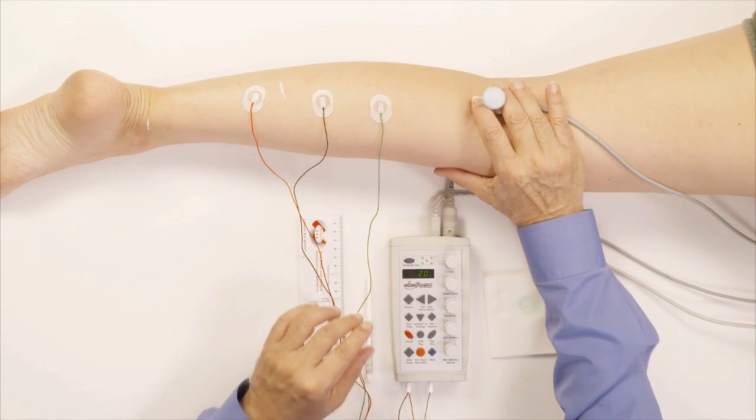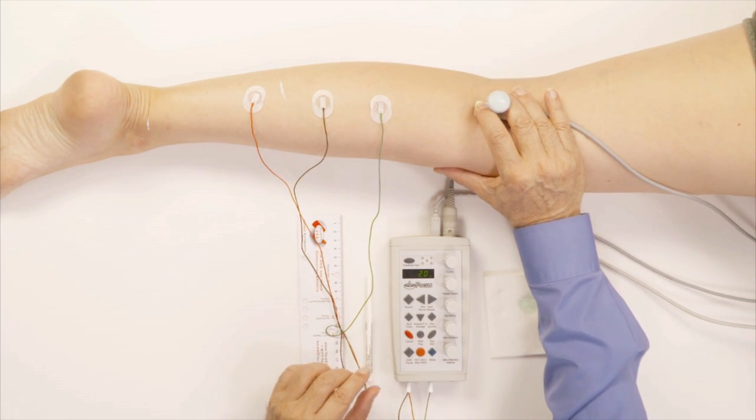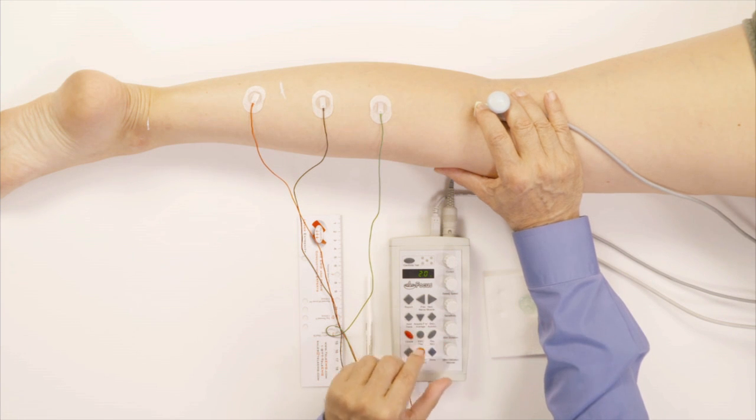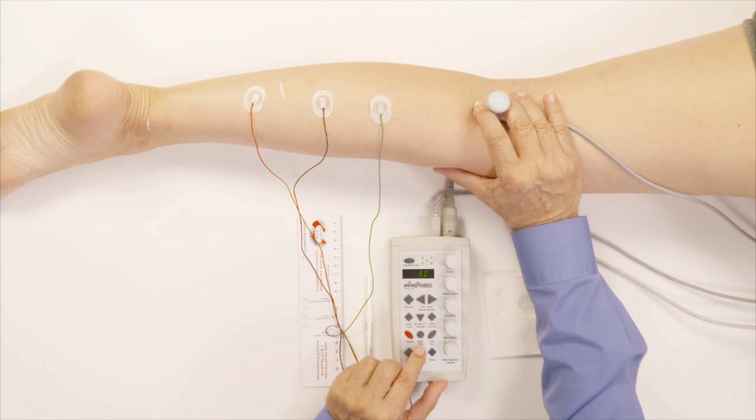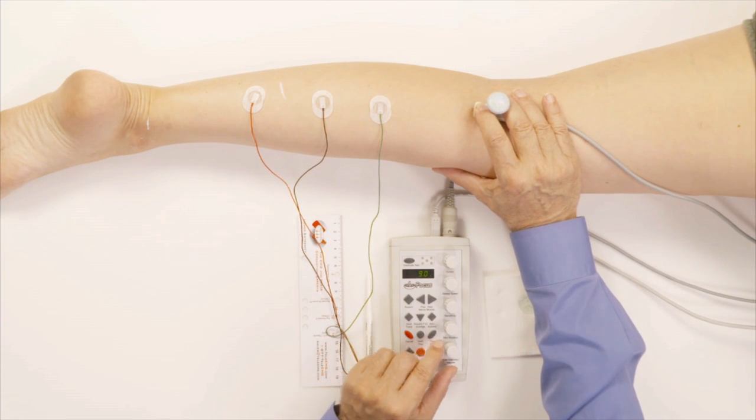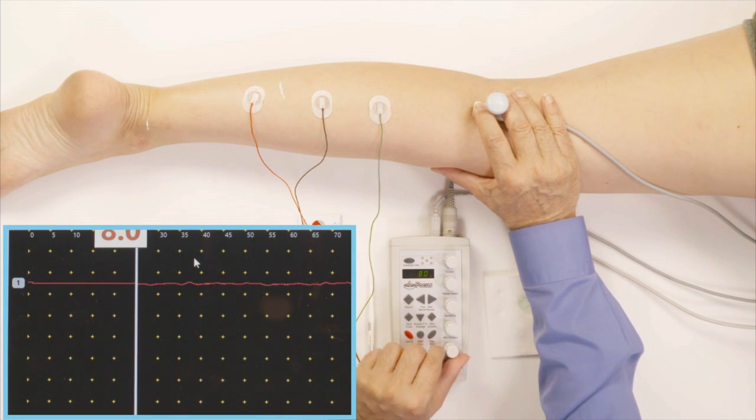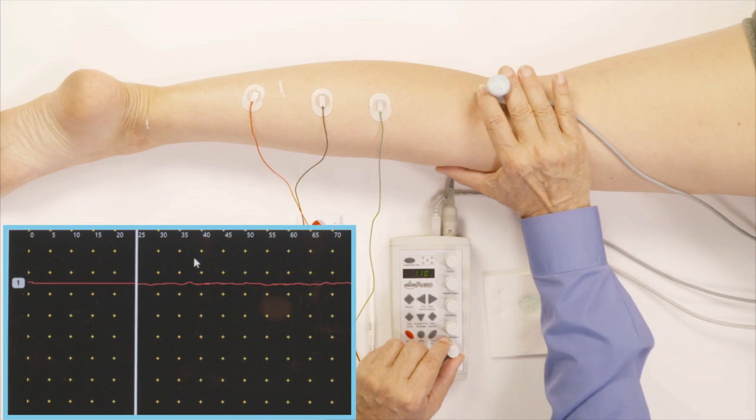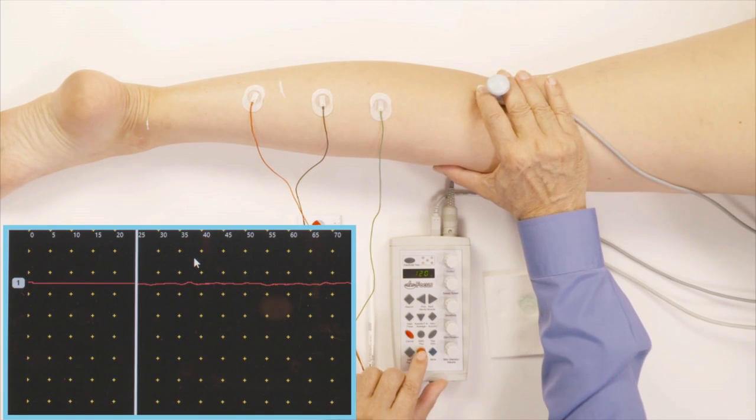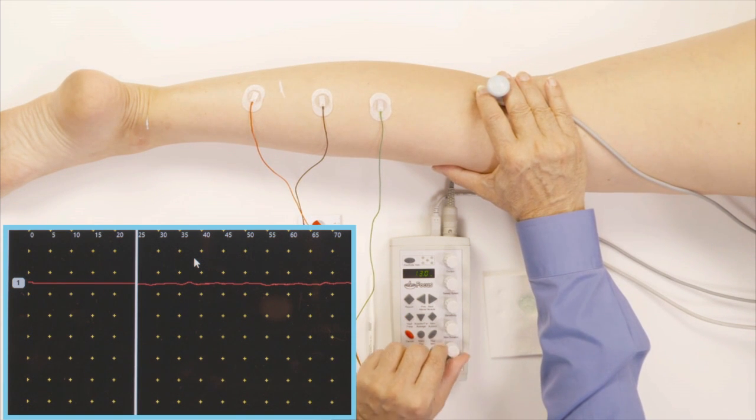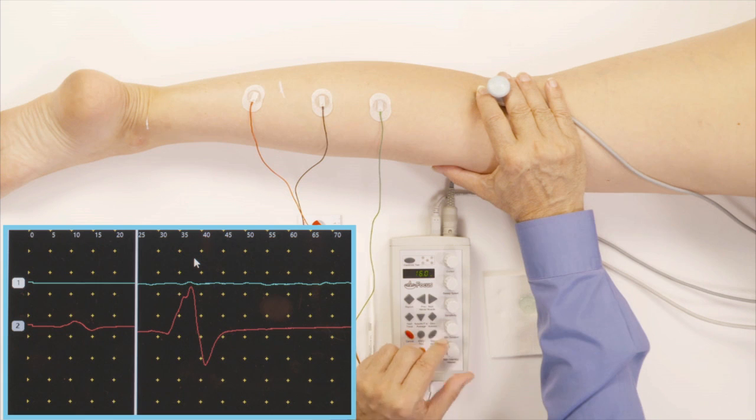Here we go, I'm gonna start. But you don't have to go very high here because you can get the H reflex much sooner and much faster than you can get an F wave. So I start like at eight or nine, I don't go much higher at that point. And you will see a wave developing right here. Here we go, and I got it right away.